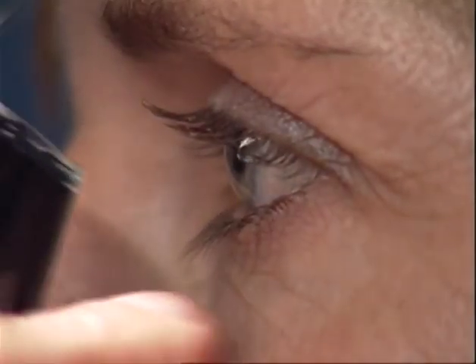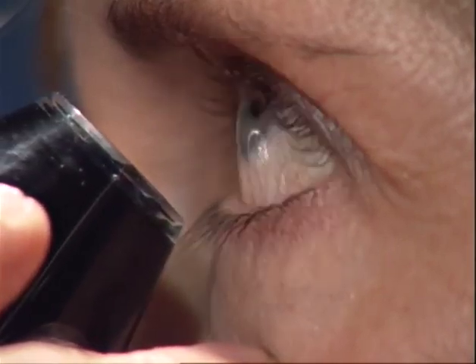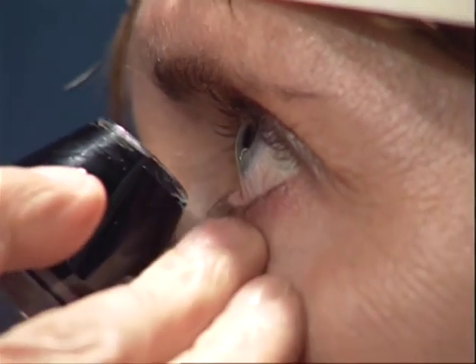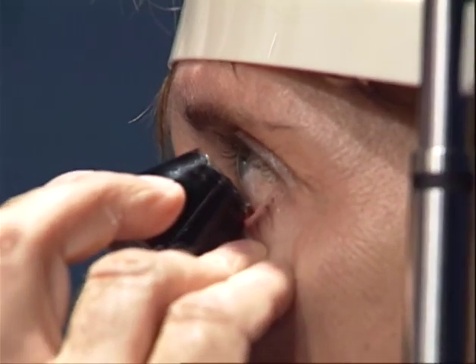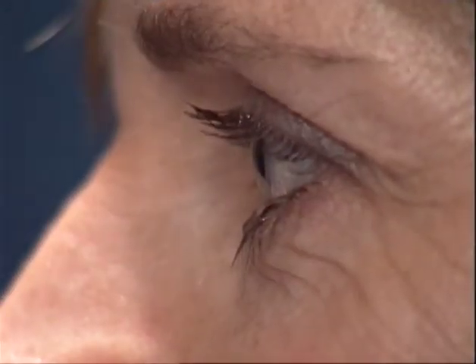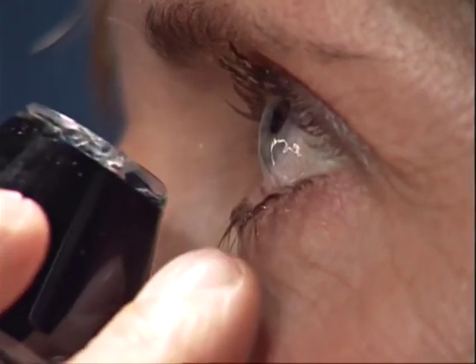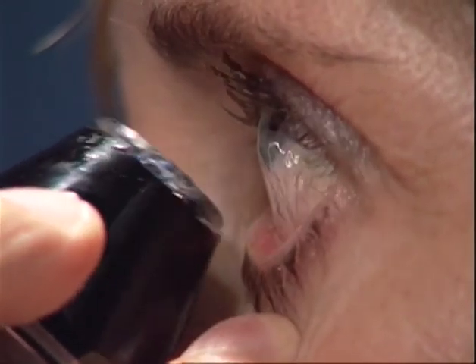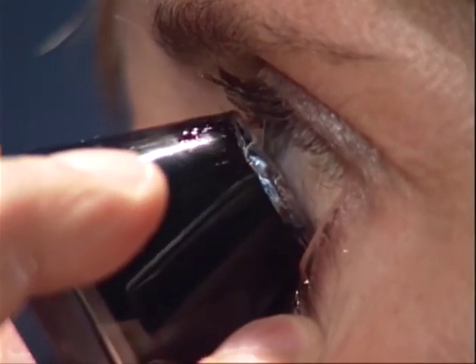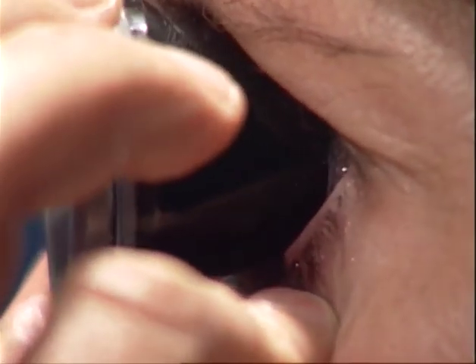In the method of the lower limbus, the patient is asked to look upwards. Then the upper lid will be retracted automatically. The lower lid is pulled down by the examiner with one of the fingers of the hand holding the contact glass. The contact glass, whose cavity previously was filled with a viscous lubricant, now is opposed to the lower sclera with its lower rim and then is tilted upwards until its concavity is in contact with the cornea, while the patient is asked to look straight ahead again.